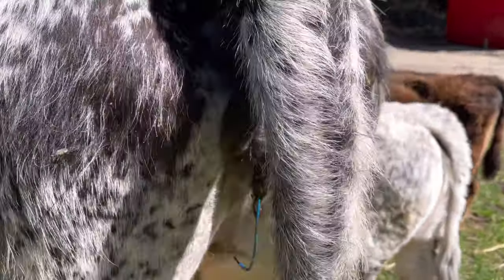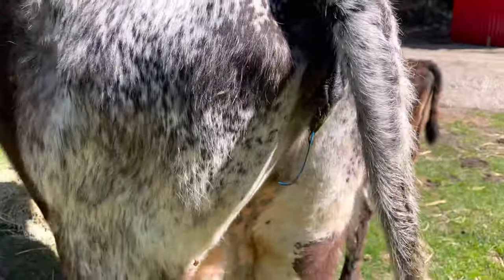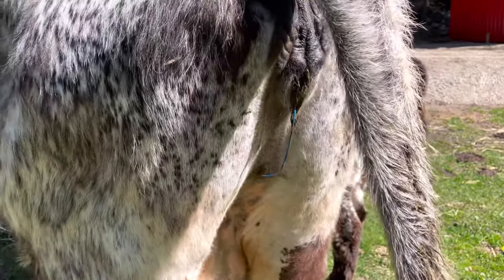This is what it looks like on Daisy — that was the one I had a little harder of a time with. I think she has a shallow vault. Daisy is a new cow to us, so I've never done any work with her and I'm not familiar with her anatomy. But I think it's in there good.